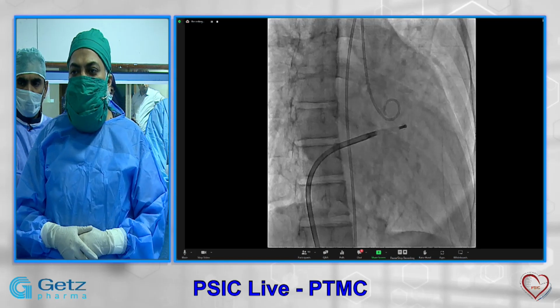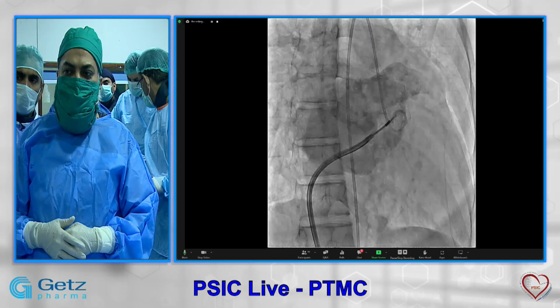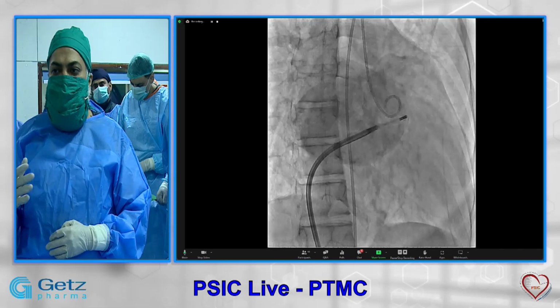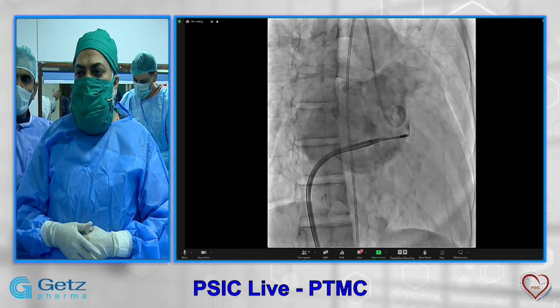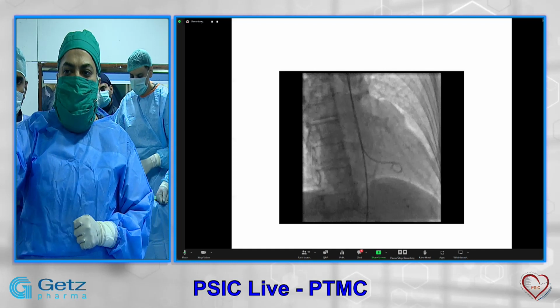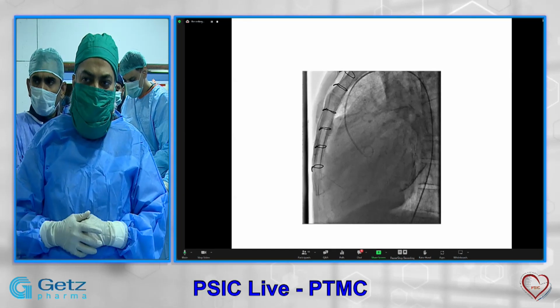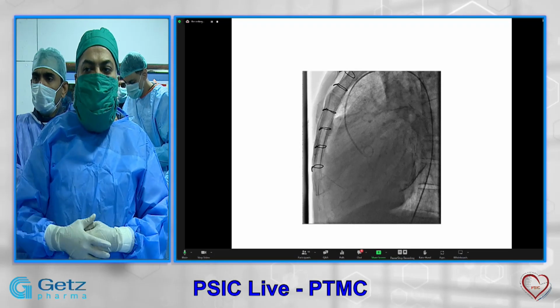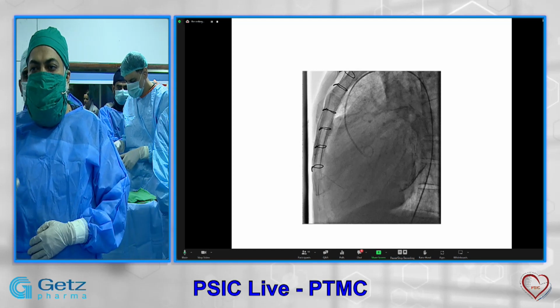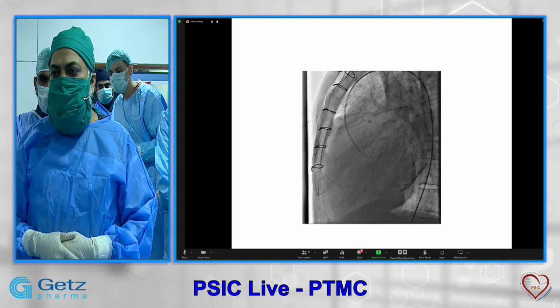Next. And this is the anatomy, because we will be puncturing the septum in the lateral view. So how does the septum look in the lateral view? Next, please. I'll just go directly to a slide. You can see this was a case with a calcified LA, so you can have an imagination of where the LA is once you see it in your heart. Next, please.